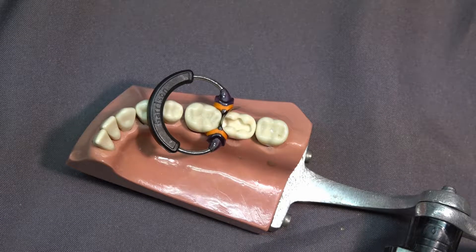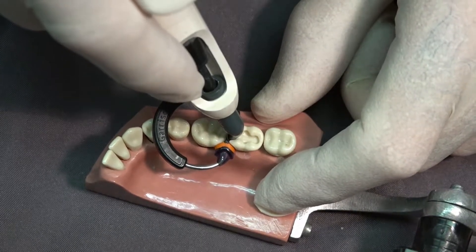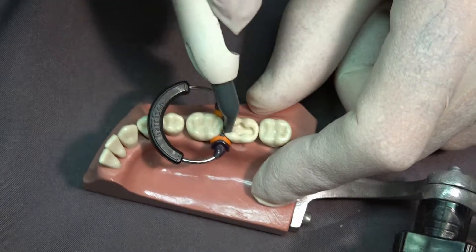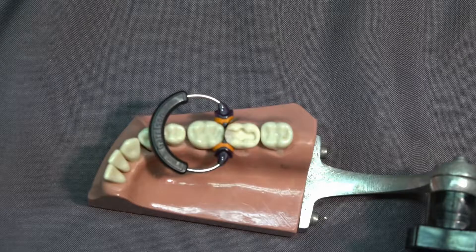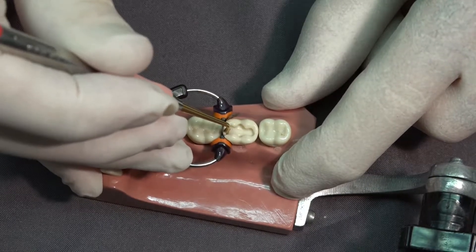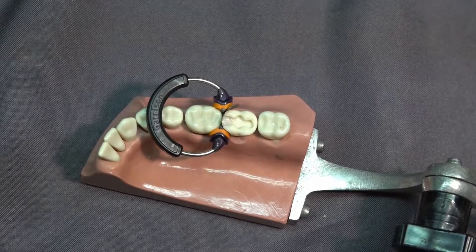We're now going to take composite. Some composites allow you to fill this all at one time — I usually fill it in two increments. I condense the first increment and then light cure it.